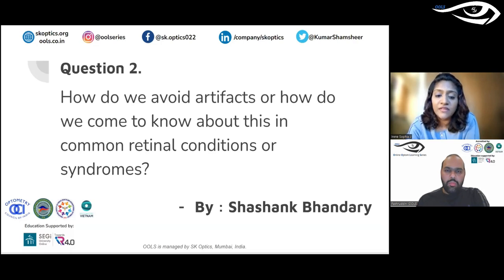And that is the reason for the electrodiagnostic setup. Even though all the manufacturers come up with their normative data and the values they give you, it's definitely not going to be as good as the normative data that you create in your own clinic, because the room illuminance, the instrumentation, and the electrode that you use all alter the normative data. So every clinic needs to create their own normative data for each of the tests, and then compare it with the patient's data.